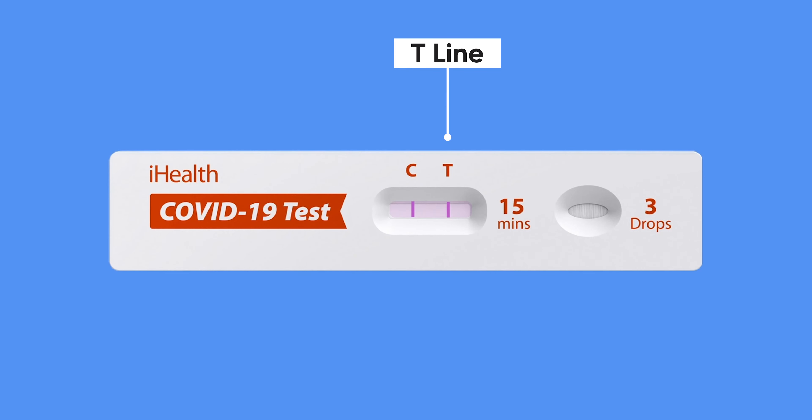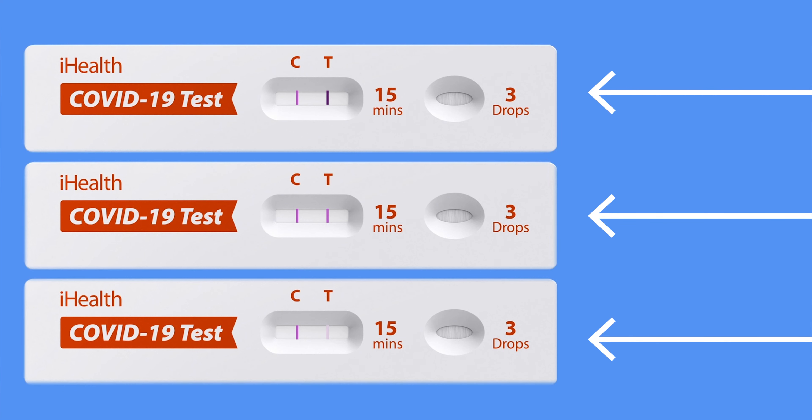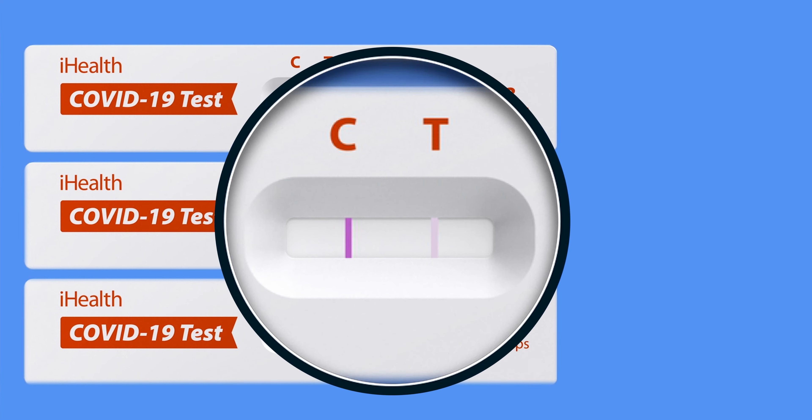The T line is the test line. A line will only appear under the T if you have tested positive for the virus. If there is no line under the T, then the test did not detect any virus in your sample. Nice! Be aware that, depending on certain factors such as how long the virus has been in your system, the line under the T may be very faint. Regardless of how light or dark, any line at all under the T means that you have tested positive for the virus. If you're unsure, you may wish to use a magnifying glass or hold the test card under a bright light for closer inspection.